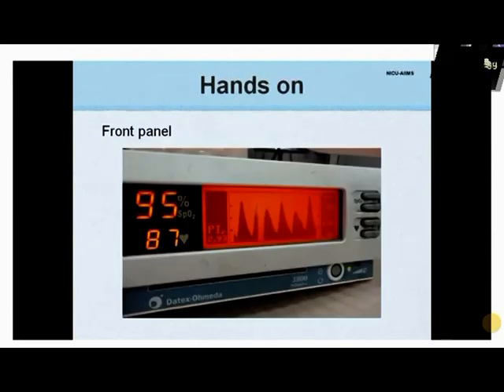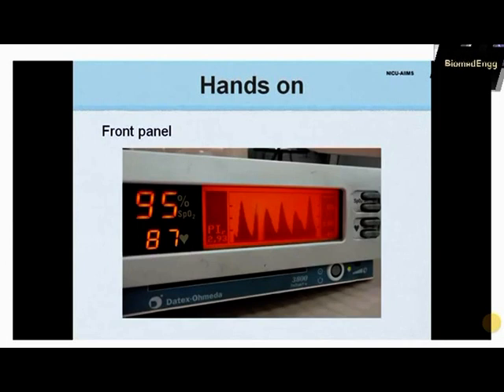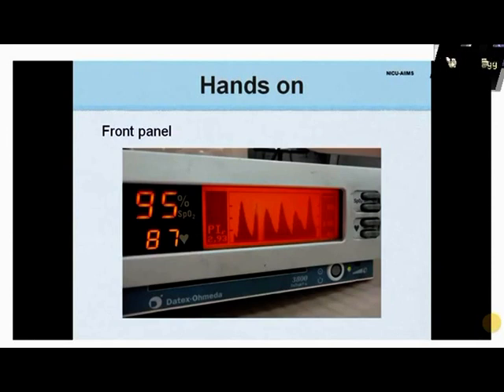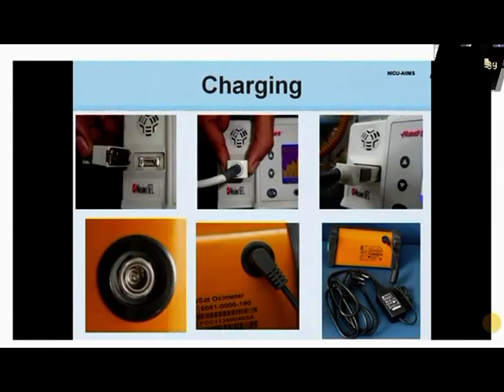Now that we have understood the basic working mechanism of pulse oximeters, let us have a hands-on look at the essential requirements for using these monitors. The front panel has a display screen and multiple buttons to adjust the parameters, alarm limits, and the setup.